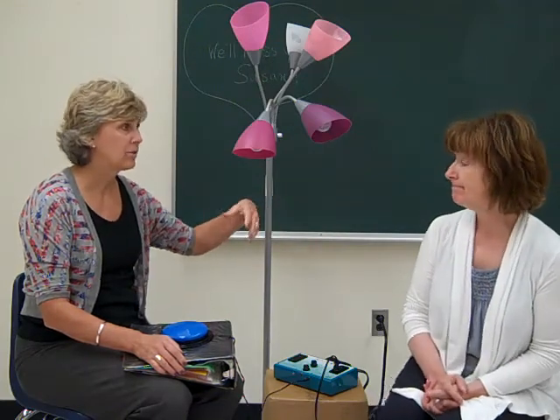She has progressed over the years with touching the switch. I believe because we've consistently done this for years, she just recognizes the setup. Her aide repeats it, so she's doing it not just when I'm here. Does she need that 20 to 30 second wait time after the single command? Yes. I might realize I'm talking too much. 'Jane, move your arm and touch the switch if you want to see the lights and hear the radio' — and then I might wait 12 seconds and then repeat that.